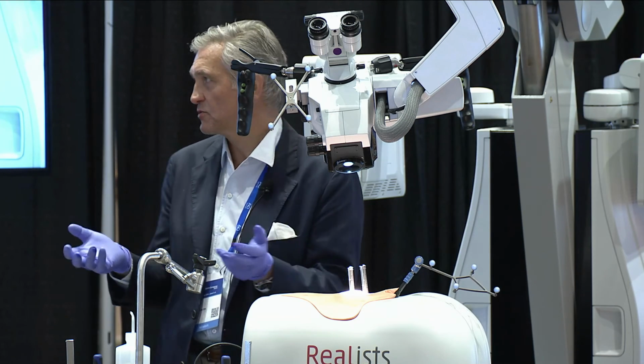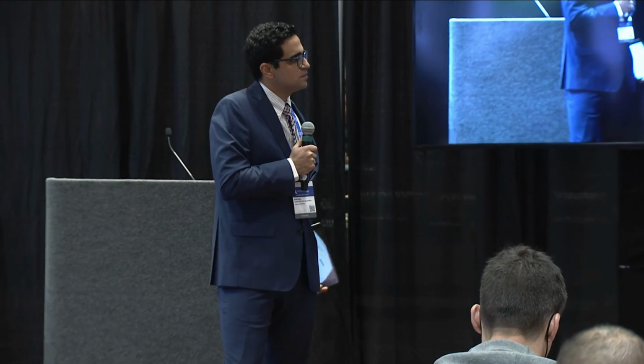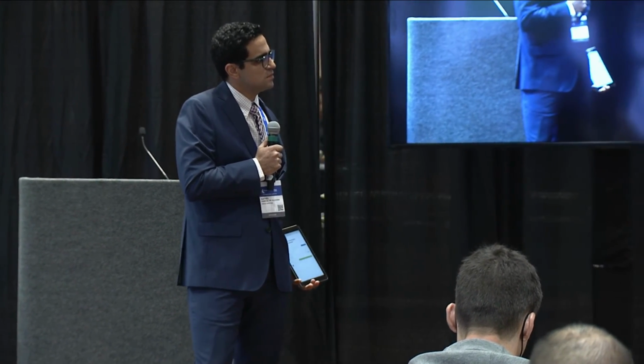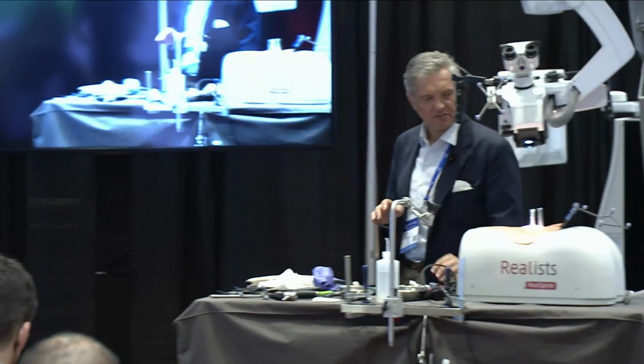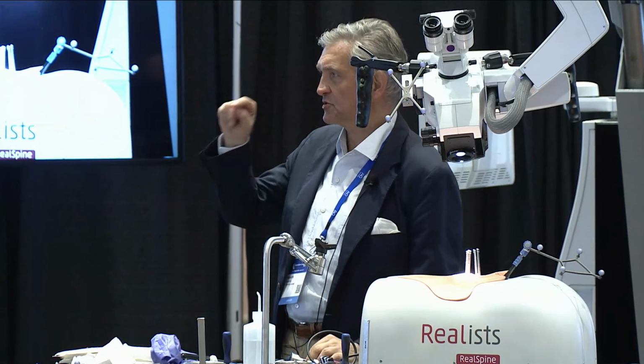Okay. Any questions? Yeah, one question, Dr. Hartl. Do you think that using navigation increased your ability to have a better positioning for the cage? Because we know that it's important for the cage to be anterior, so we do not have a very kyphotic situation. Absolutely, and that's why I use the pointer always to confirm the trajectory of the tube, because the trajectory of your tube is going to determine also the trajectory of your cage.